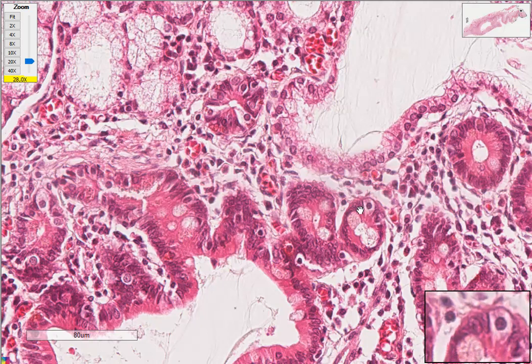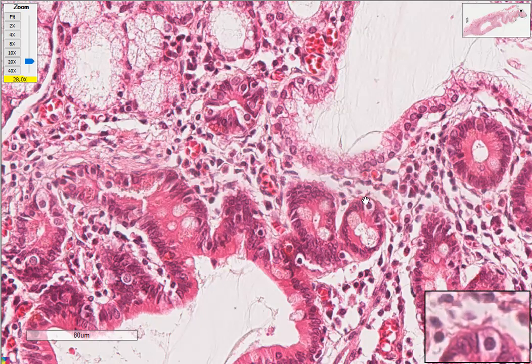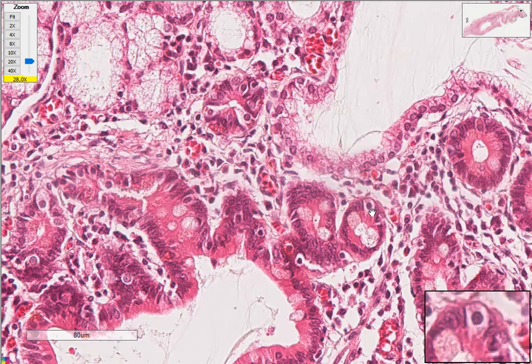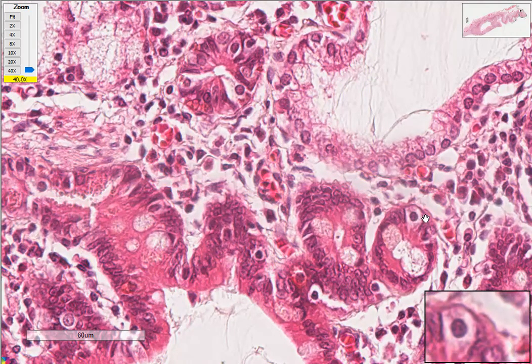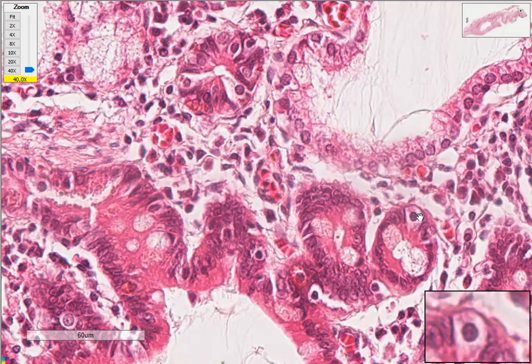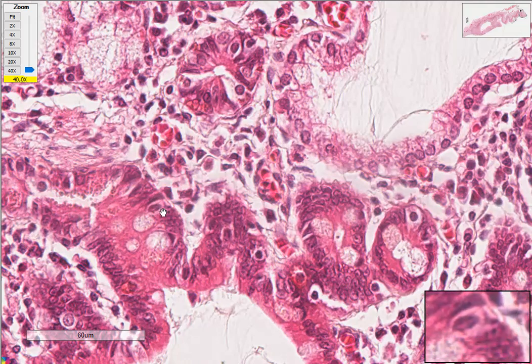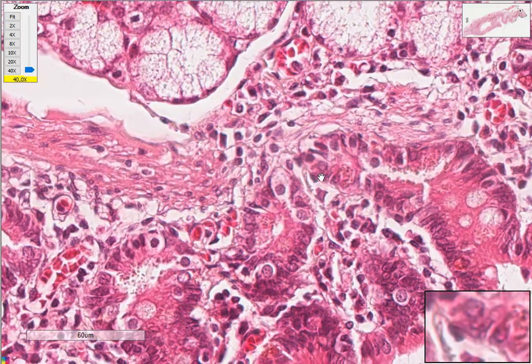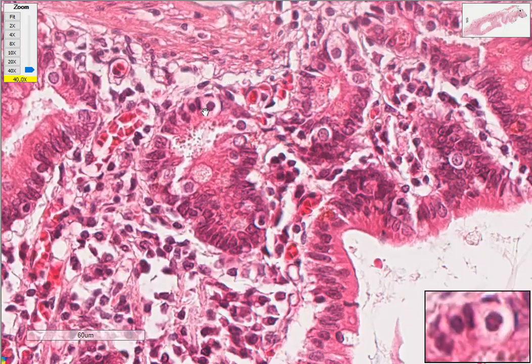How you identify them is they have a pale cytoplasm. So this is your enteroendocrine cell. I can highlight quite a number of them for you. Here's one, here's another one, here's another one, here's another one. There are quite a number. Here's another enteroendocrine cell.